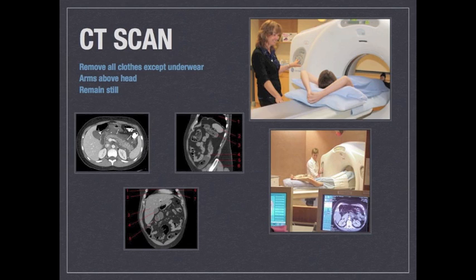After this is done, he or she will be there for about 30 minutes tops, where the machine's X-ray beam will rotate around his or her body without stopping, generating images or slices of images that will later appear on a monitor, where they can be reconstructed in a sagittal, axial, or coronal view.